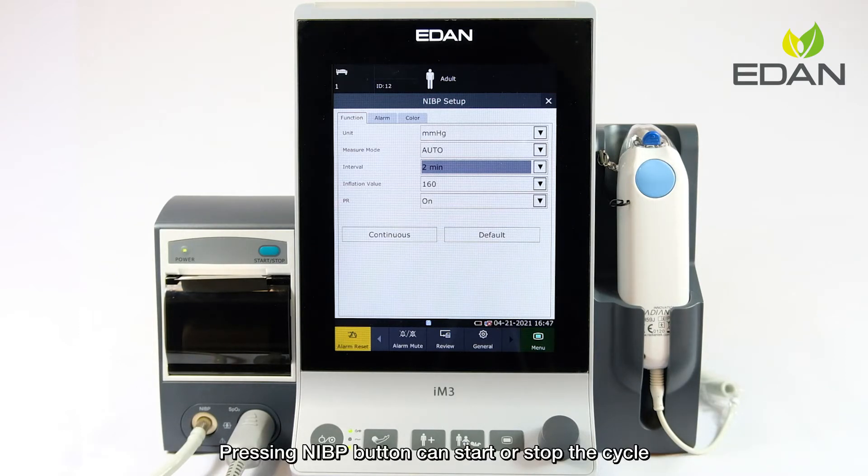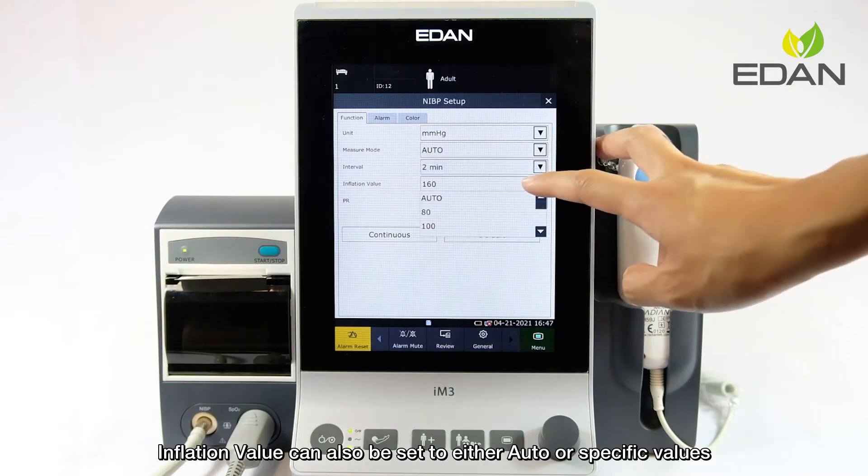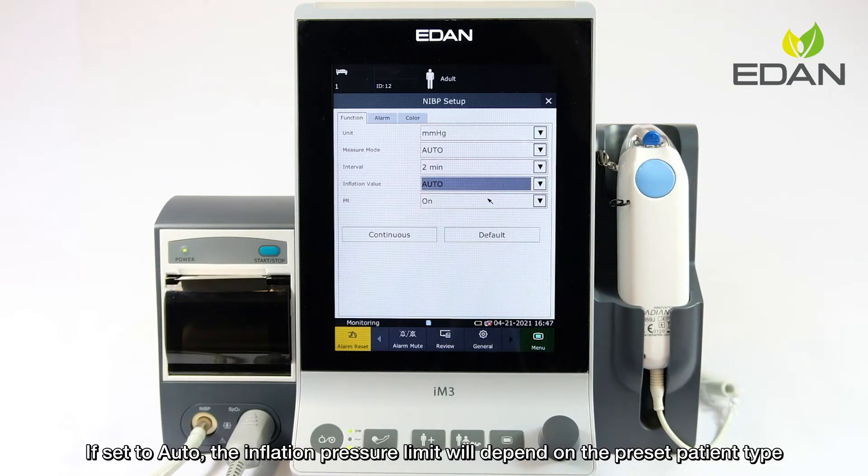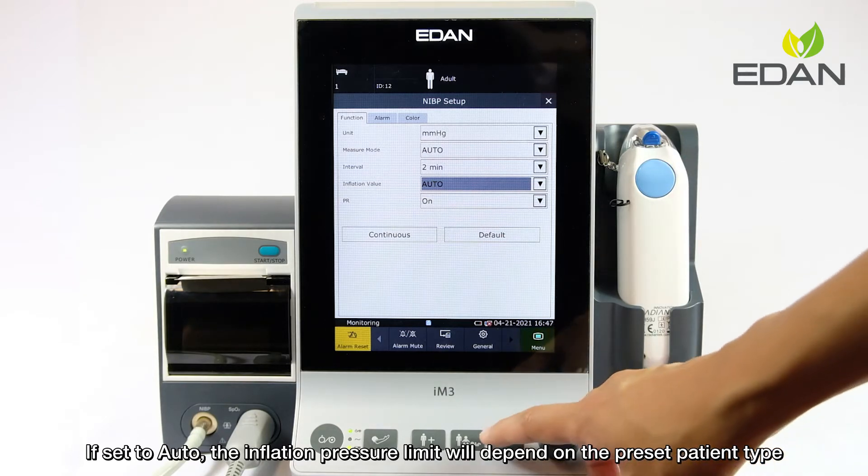Pressing the NIBP button can start or stop the cycle. Inflation value can also be set to either auto or specific values. If set to auto, the inflation pressure limit will depend on the preset patient type.